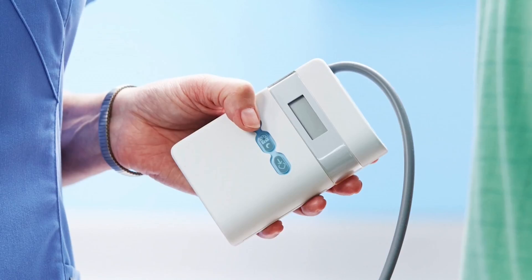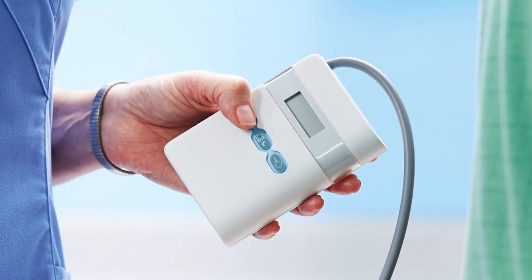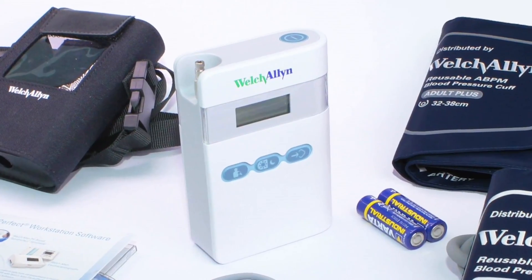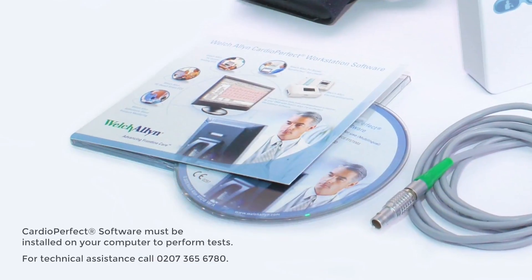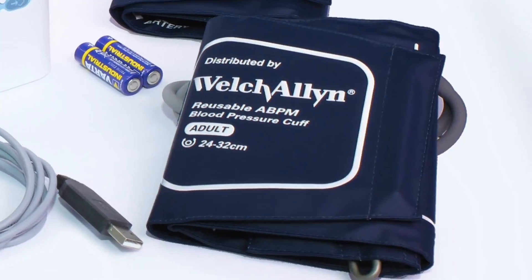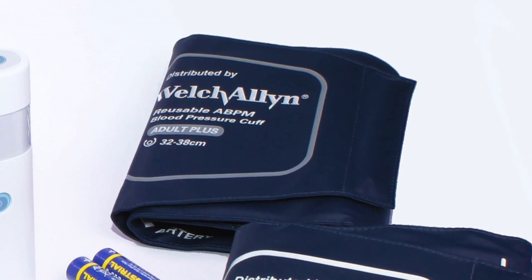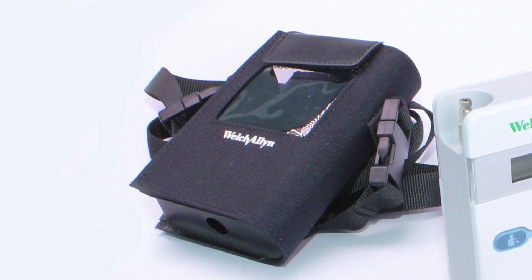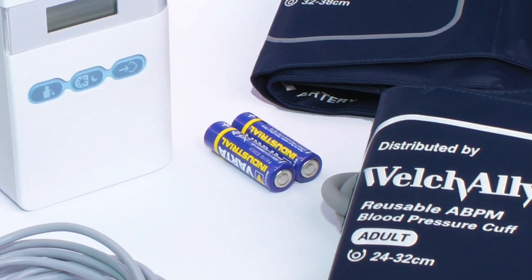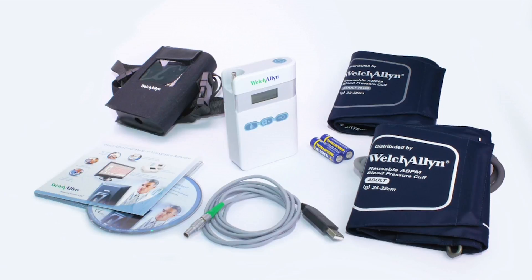First, let's take a look at the components of the ABPM 7100. Out of the box we have the ABPM itself, the CardioPerfect software which needs to be installed on your computer, two cuffs — adult and adult plus — a carrying case, a USB interface cable, and finally AA batteries to power the device. Rechargeable batteries can also be used.